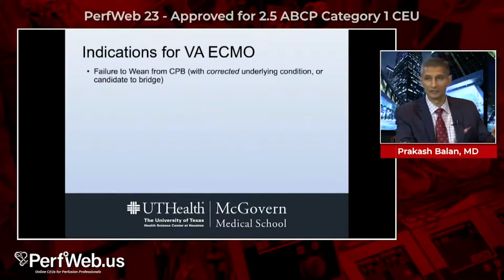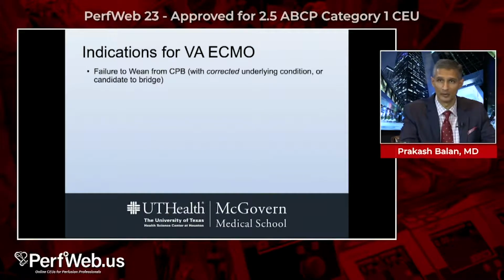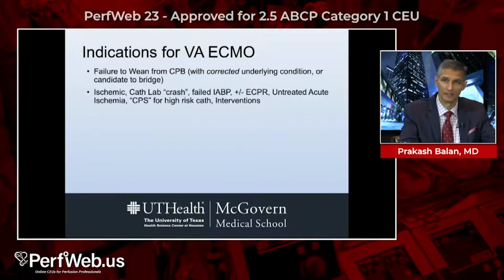What are the indications for VA ECMO? There are a number of them, and these indications are growing and broadening as we continue to learn. Obviously, failure to wean from cardiopulmonary bypass has traditionally been a reason to place a patient on ECMO. More often now, what I do, I'm an interventional cardiologist, it's the cath lab crashes, the failed intra-aortic balloon pump. It's not enough support for the patient. I'll show you a case of that later in this presentation.